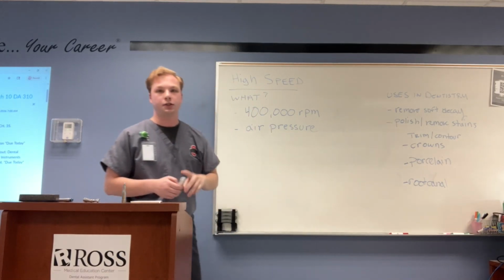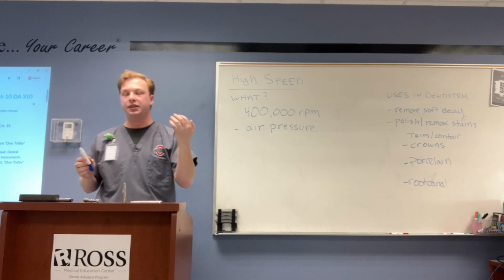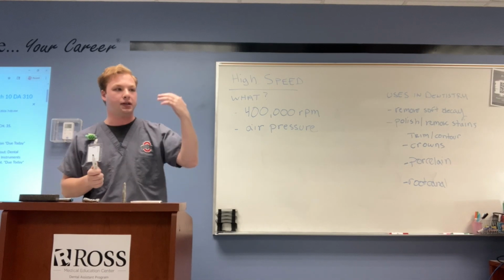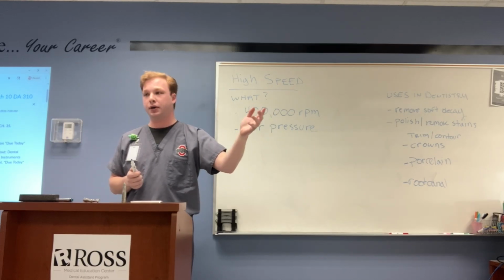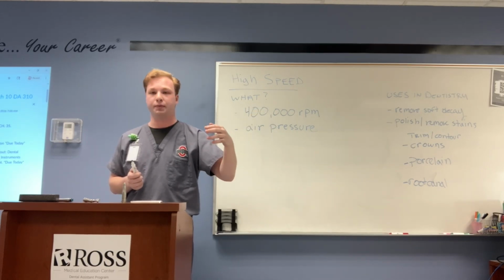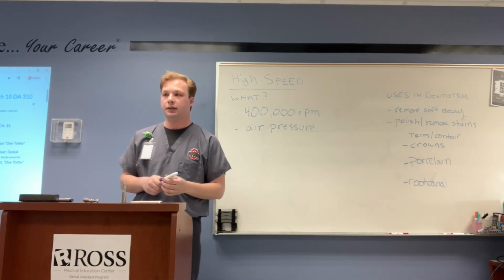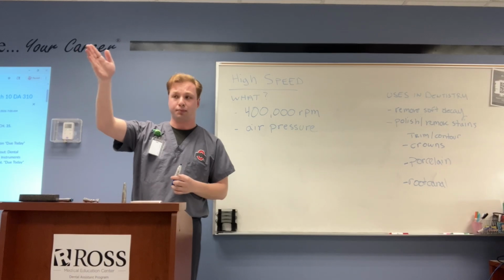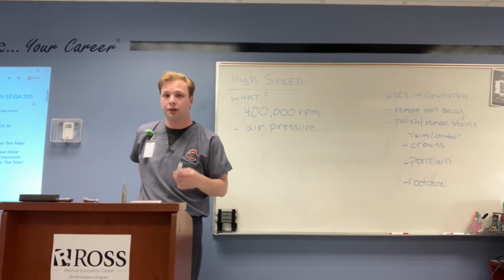Okay? So we hook it up to our tube. It's operated by air pressure, so if there's an air leak or something happens like almost a year ago where the tube from the wall kept popping out, then you wouldn't have air pressure. If your compressor's not plugged in, then you're not going to have air pressure, your drills aren't going to work, or your handpieces won't work.